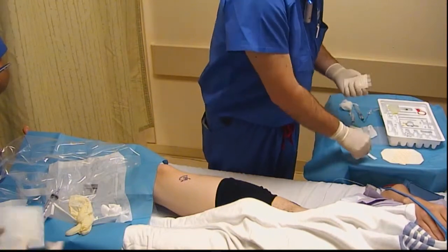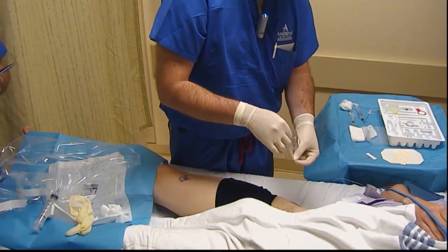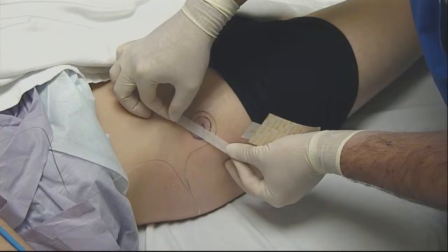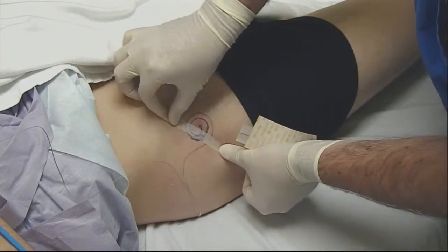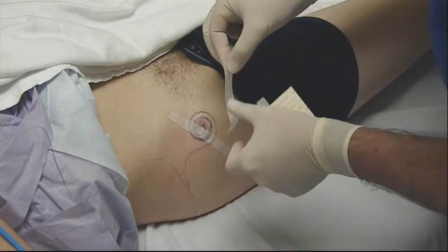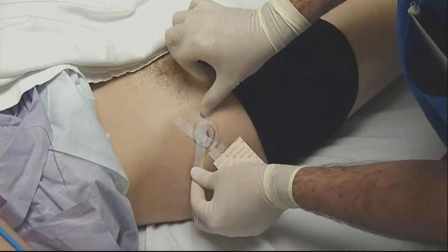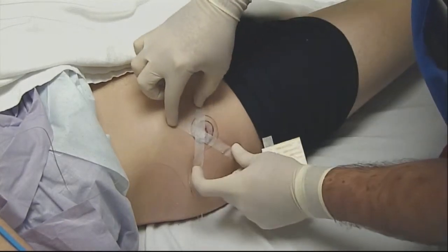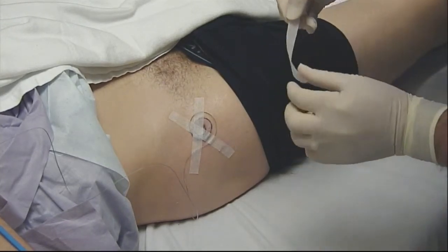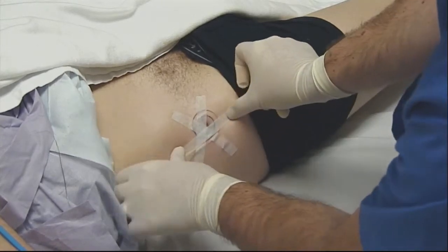The next step in this dressing application is to put on a couple of Steri-Strips to hold everything in place. I make a point of not covering that puncture site — that way if the patient comes back in for evaluation and the catheter is not working, we can see exactly where it's located at the skin and make sure it didn't get pulled back, and that's the reason for it not working. I apply three Steri-Strips here and try to be considerate of the patient and avoid any unnecessary waxing when he takes this off.